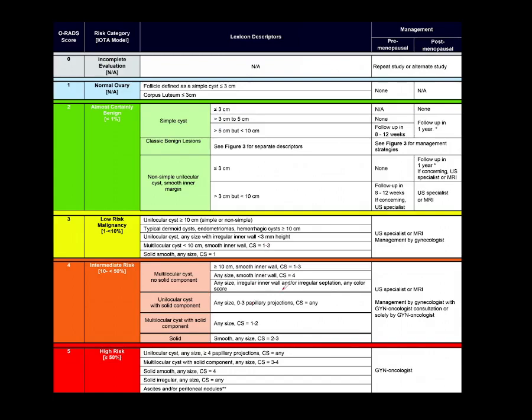It's from the American College of Radiology. If you search for that, you'll be able to find it. It's quite a useful app, and it takes you through how to diagnose the lesion, and it helps you perhaps to get a better idea of management than the Iota. I think they're both very good, and I think it's rather a matter of personal preference which one you use. But I would try and use one of them if you can, because they give some validity to your opinion.